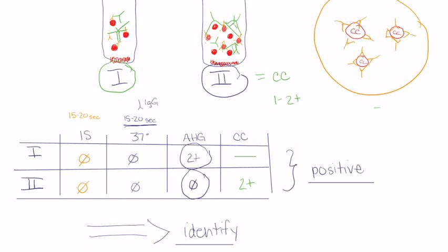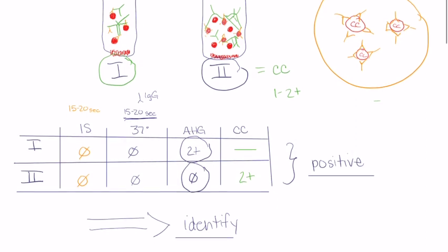Okay? What is it? And when we talk about HIV or strep, we do a confirmatory test that's actually more specific to those infectious agents. Okay, so now what we do here is we're going to do a confirmatory test to identify what the antibody actually is, and we're going to do an antibody panel. Okay, an antibody panel, or what you might hear someone say is an antibody ID. Okay, because we want to identify it.